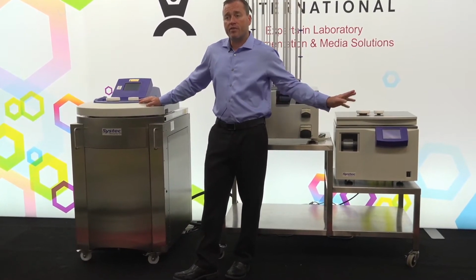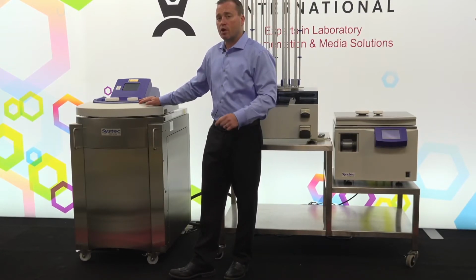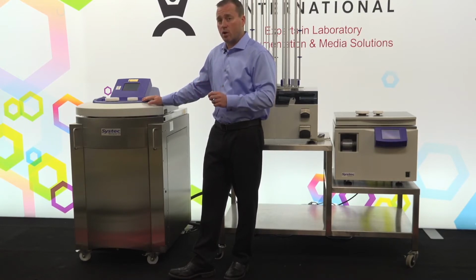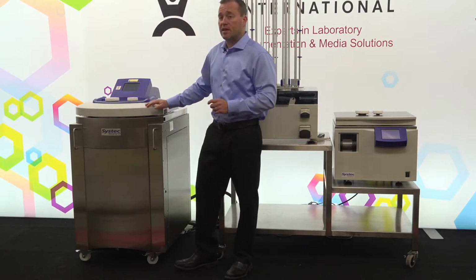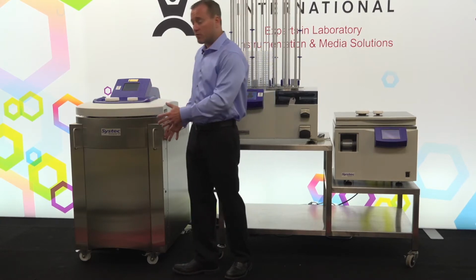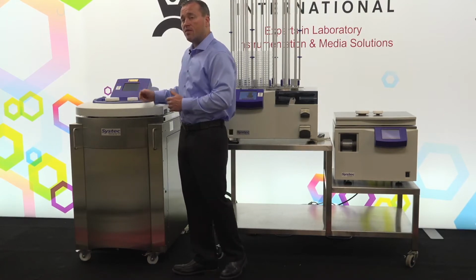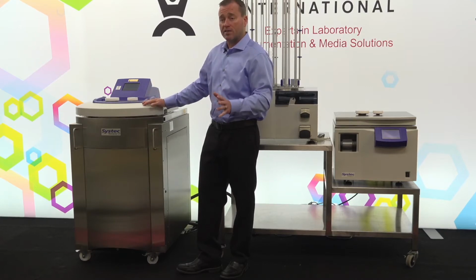After the 10, 20, and 30 that are built in this fashion, we would have systems that look a bit different here, and those would be the 45, the 65, the 90, and the 120. Each of these would look very similar to this. The 90-liter system is on the same chassis as the 120, so it's just a bit shorter but the same width, so it gives you a good idea of how large the system is.